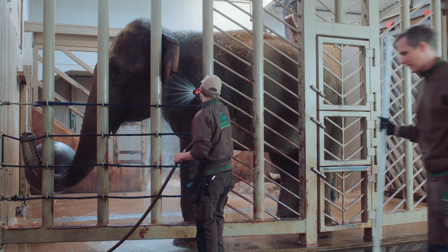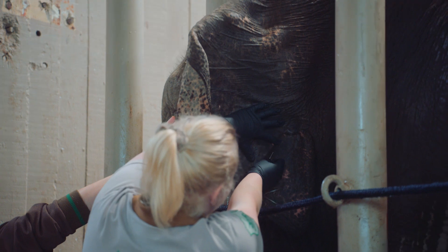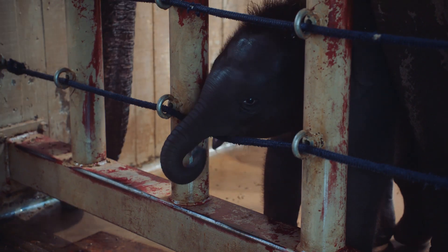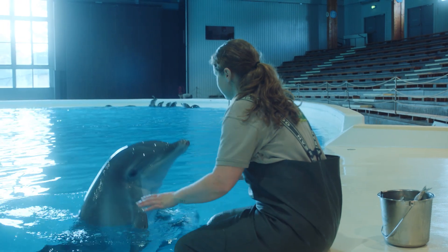In addition, Exego gives you the flexibility to develop your own profiles. Exego users globally have added more than 50 different animal profiles to the analyzer.